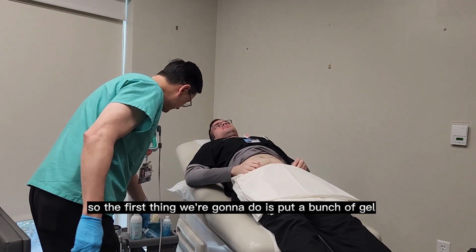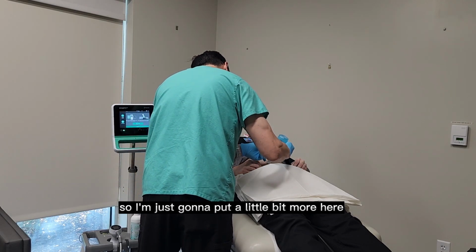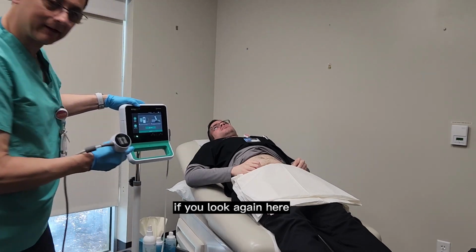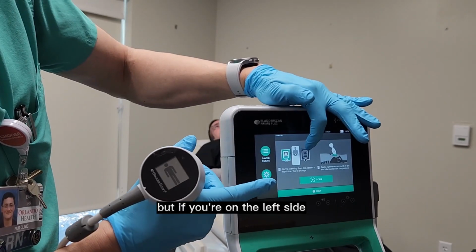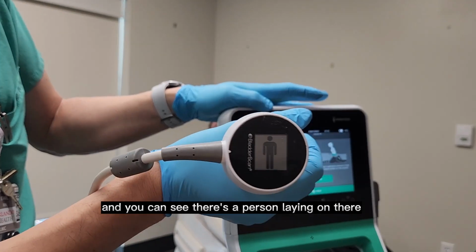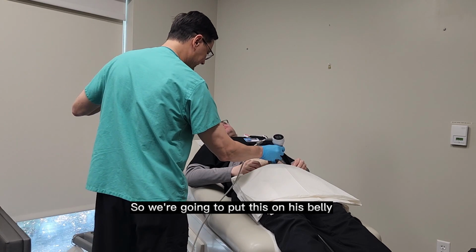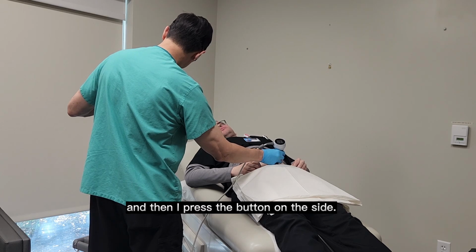All right, so the first thing we're going to do is put a bunch of gel on his belly. I already have some on there, so I'm just going to put a little bit more here. And typically it's about a little over an inch above the pubic bone. Now this scanner, if you look again here, it has this checked off because I'm going to be on the patient's right side. But if you're on the left side, you actually press this button right here, and you can see there's a person laying on there, and you should be on the correct side to get the most accurate scan. So we're going to put this on his belly now. I move that gel around, and then I press the button on the side.